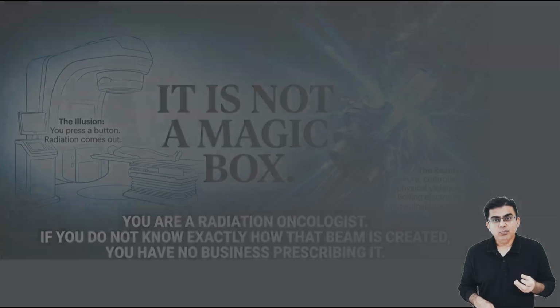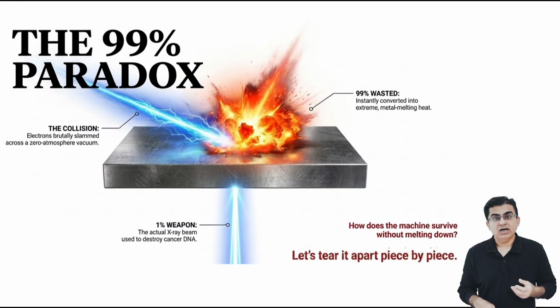We are vigorously boiling off electrons at thousands of degrees. We are accelerating them to unimaginable speeds across a complete zero atmosphere vacuum. And then we are smashing them into a solid piece of tungsten.